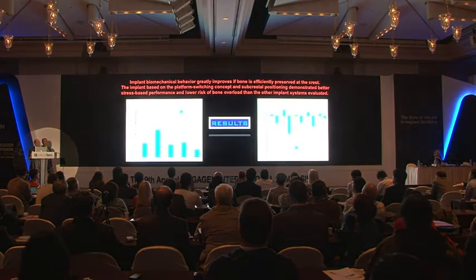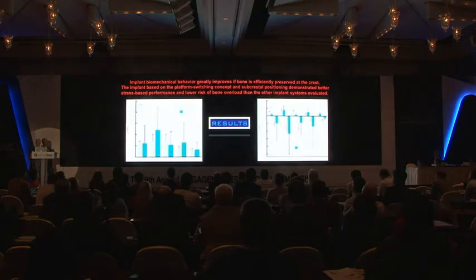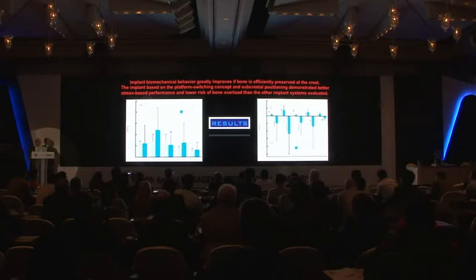And the result is very important: it shows better performance in the load transfer, even in the compressive and tensile forces on your right, of the implants with bone on the platform and conical connection. This is a dramatic change. The behavior of the implants with this kind of condition is completely different, biomechanically speaking.